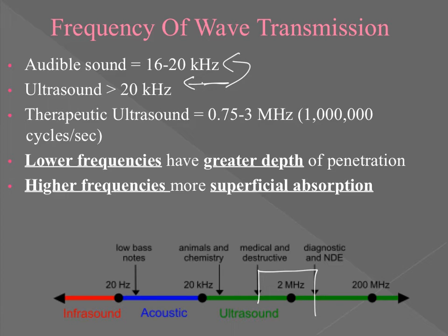And that's key, right? We don't want to put an ultrasound on a pregnant woman and increase heat within the uterus, right? And so those are key distinct features as you're trying to figure out, well, what is the major difference between therapeutic ultrasound and diagnostic ultrasound? It's really about where they lie on that frequency spectrum and how many waves they're able to produce, right? Okay, so one hard concept for students to grasp a lot when we get into the ultrasound segment is depth of penetration.